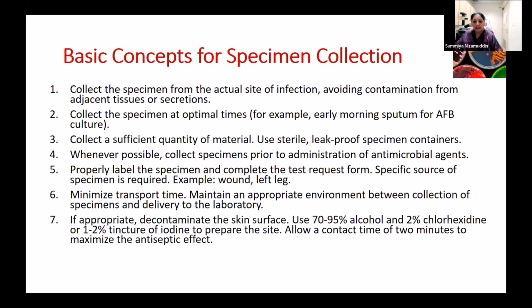If appropriate, decontaminate the skin surface before aspirating a sample. For example, if a patient comes to you with an abscess and you need to draw the specimen, or perhaps you're planning to do an LP, it's always better to decontaminate the skin surface properly, first with alcohol, and then with either chlorhexidine or povidone-iodine, then allow the disinfectant to dry, and then go ahead and draw your sample.